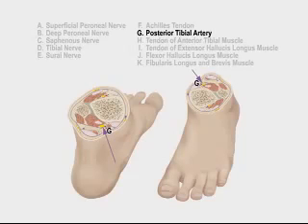easy. Please remember that the local anesthetic agents do not cross fascia layers readily, and it is thus important to place the needle in the same fascial compartment as the nerve. The method described in many older textbooks of approaching the tibial nerve from posterior until the bone of the tibia is encountered and then withdrawing the needle slightly is outdated and possibly an important reason why many ankle blocks fail. Please keep in mind that the tibial nerve supplies approximately the complete sole of the foot.